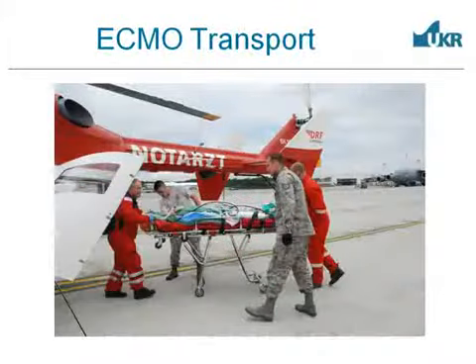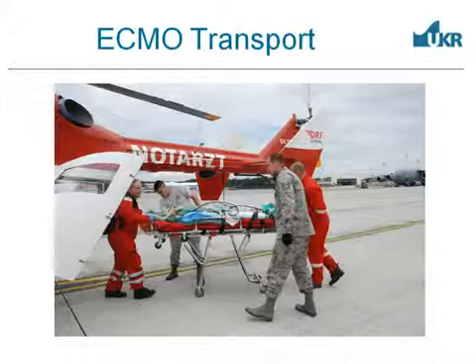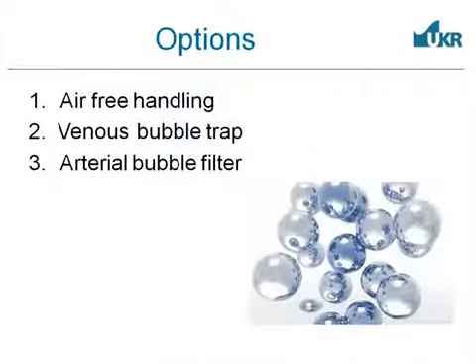We also use it quite frequently for ECMO, for all kinds of ECMO, arteriovenous and venovenous, and even for air transportation. Every now and then we even get patients from the Iraq and Afghanistan wars to bring them up again for blast injuries of the lung, and this is also done with these mini circuits.